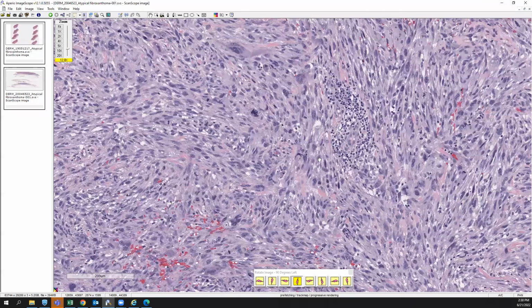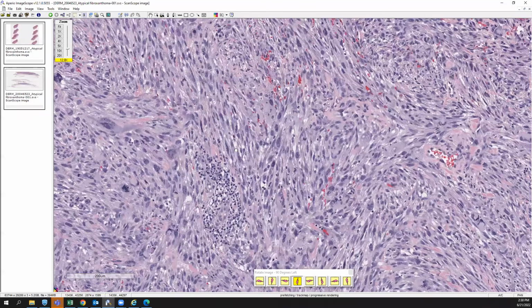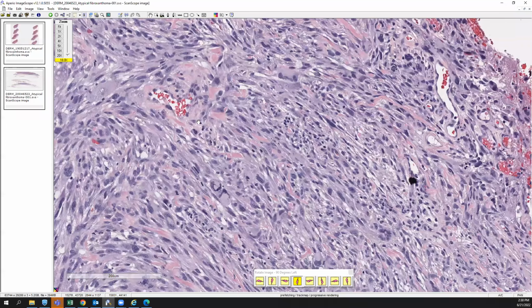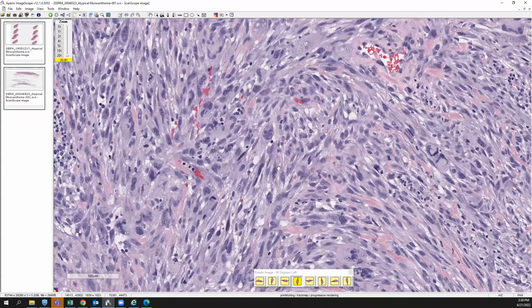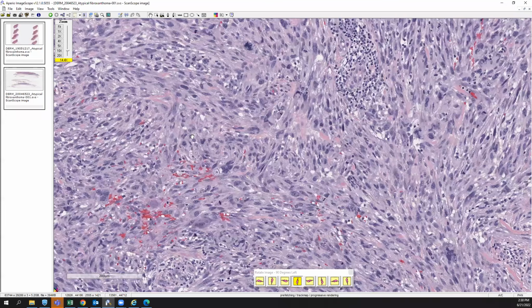And once you've excluded your smooth muscle, your squamous cell, and your melanoma, you could also think about excluding an angiosarcoma, because you can definitely have this type of pattern with this vascularization and atypical epithelioid to spindle cells on the scalp of somebody, for example. So make sure you exclude an angiosarcoma by doing a CD34 or an ERG stain.